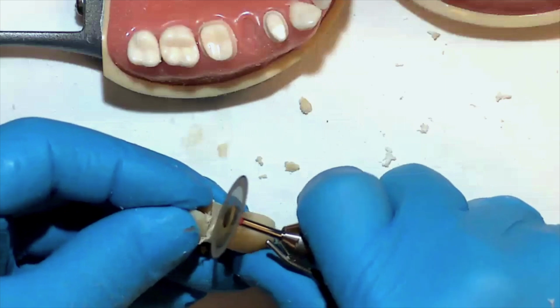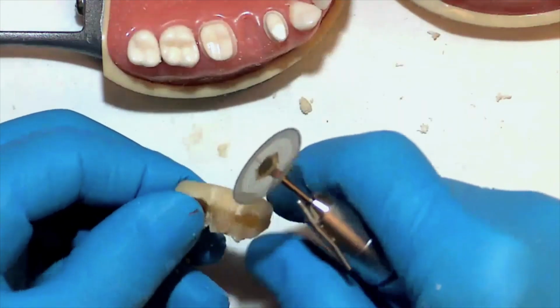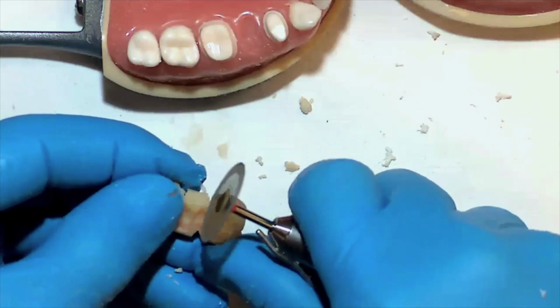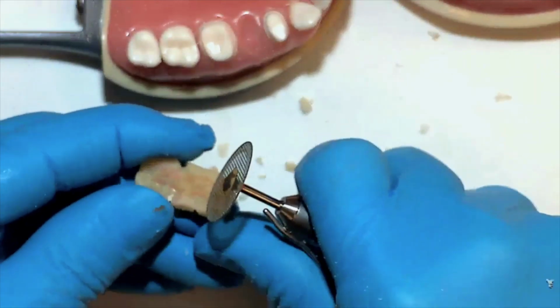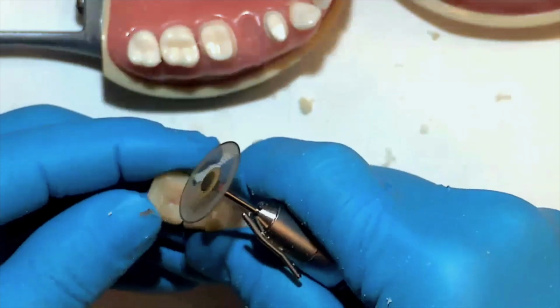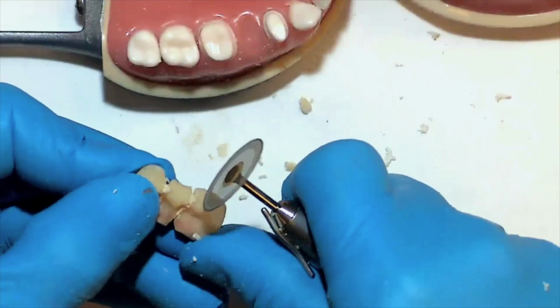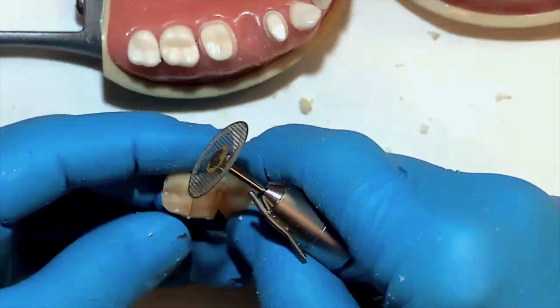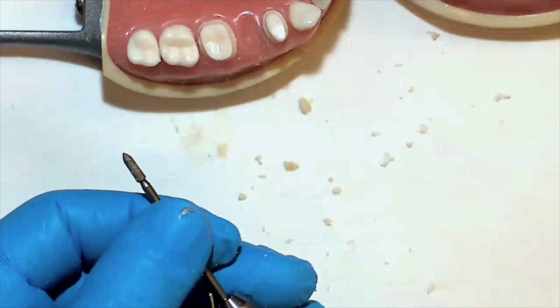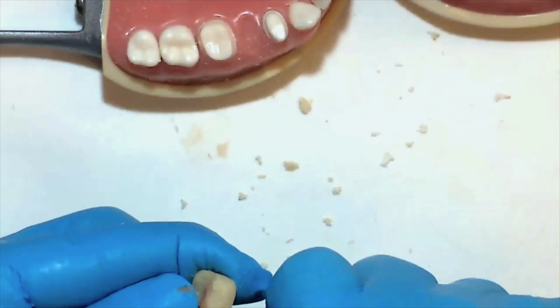Now we're carrying these separation lines over to the buccal and palatal to help delineate the three teeth better. And also onto the occlusal surface. Just a slight separation of the teeth for a landmark identification. Now switching to a diamond instrument, which isn't quite as aggressive in cutting as the acrylic burr, for refining the contours a little better.